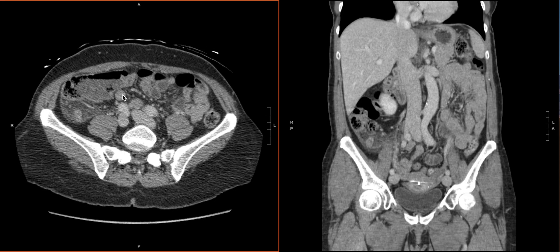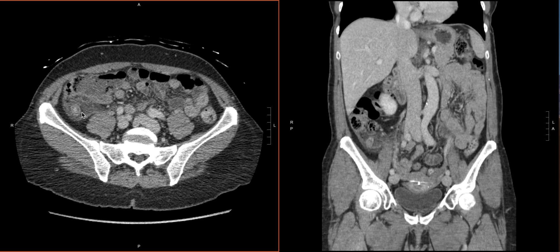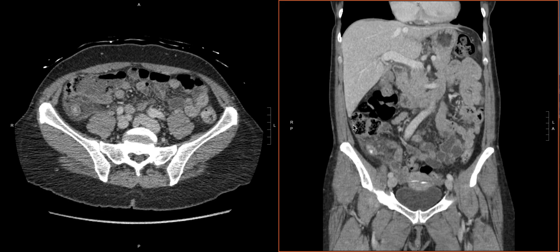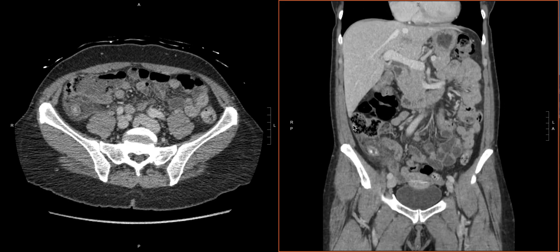The wall itself is quite hyperemic, and we can really see that hyperemia. On the coronal as well, there are areas where the wall is thickened — about 4 millimeters from measuring it. So these are all signs that the patient likely has acute appendicitis: a dilated, inflamed appendix, a lot of peri-appendiceal inflammation, the wall is hyperemic, and we also have those appendicoliths, which is very suggestive of acute appendicitis.